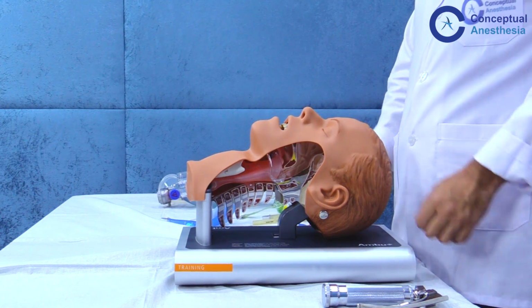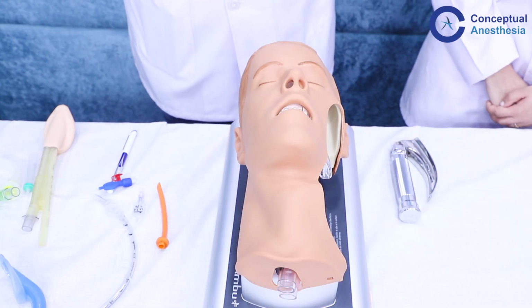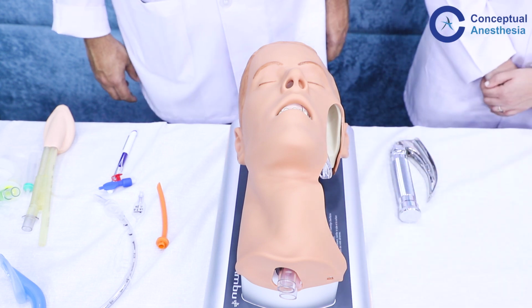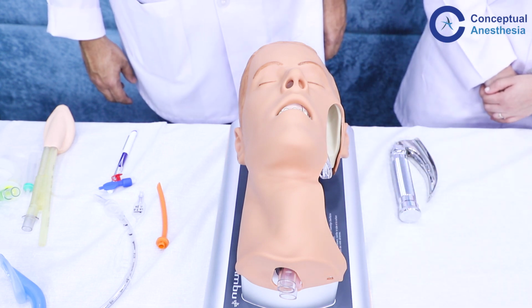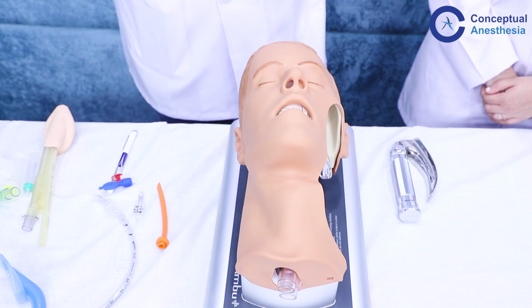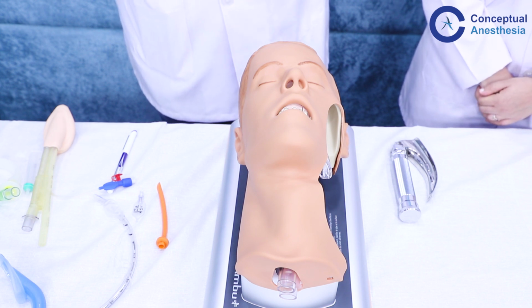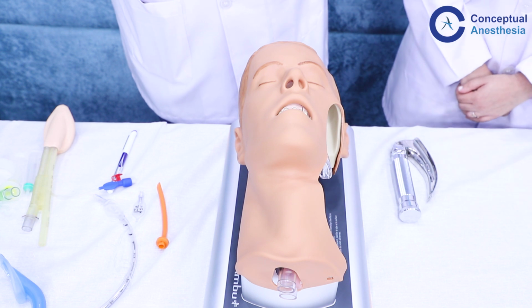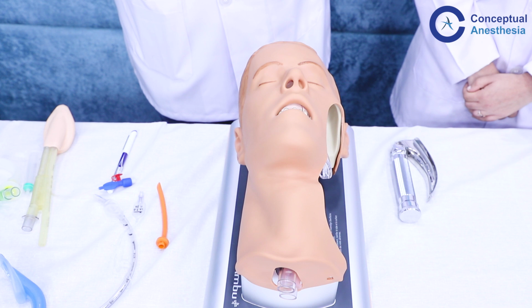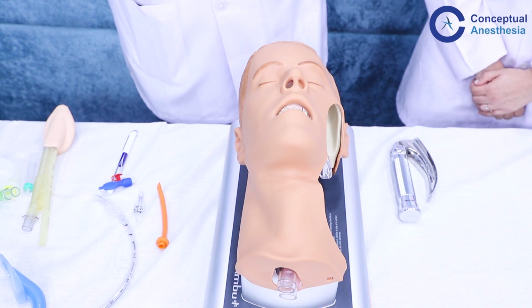the patient is rapidly desaturating at this point, the only step that we have left is to do an emergency front of neck access. So in the emergency front of neck access, we can do either a cricothyroidotomy or a tracheostomy. Tracheostomy, there are two ways to do it. Either you can do a surgical tracheostomy or a percutaneous tracheostomy. Percutaneous tracheostomy requires skill and is mostly done as an elective procedure, so it is not recommended in emergency. We will show you how to do the emergency cricothyroidotomy in this patient.